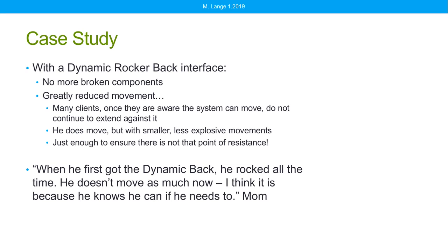And this is something I've seen a lot in dynamic seating: clients who are moving and fighting and exerting against their seating systems all the time, once they have a dynamic system, will often move quite a bit for a few months. But then it looks like they're not moving very much. They still are, but they know that they can move, and there seems to be less movement because of that. So it's interesting how that has worked. If you are working with someone using dynamic seating and think, gee, I wonder if they're still using it, just try to lock it out, and you'll see that movement come right back. I think a lot of clients are moving just enough to see how they're doing.